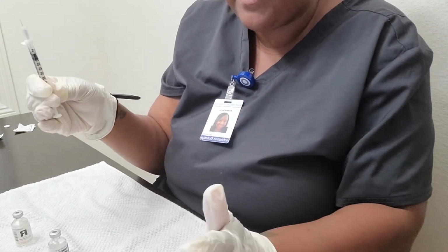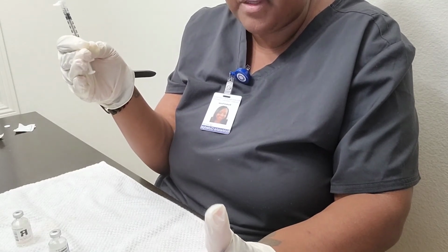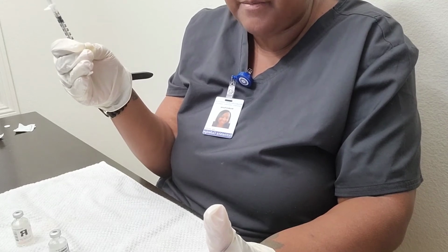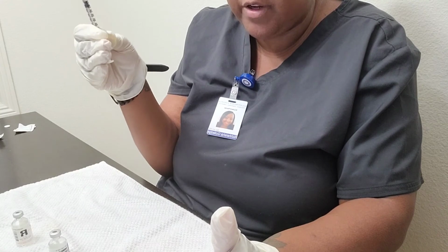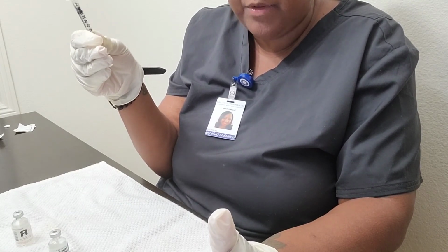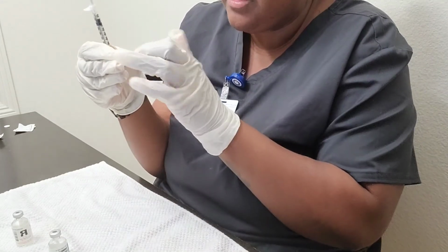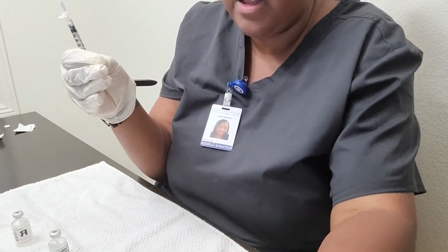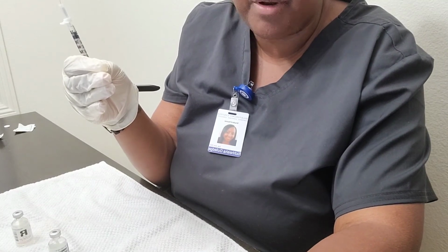Okay, and then I will confirm the dose by comparing with the EHR again, and so this is a total of 12. I'm rechecking to verify the number of units in the syringe, which is 12 units of insulin that I prepared.